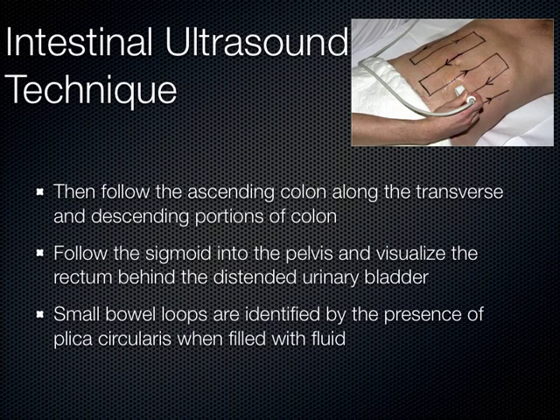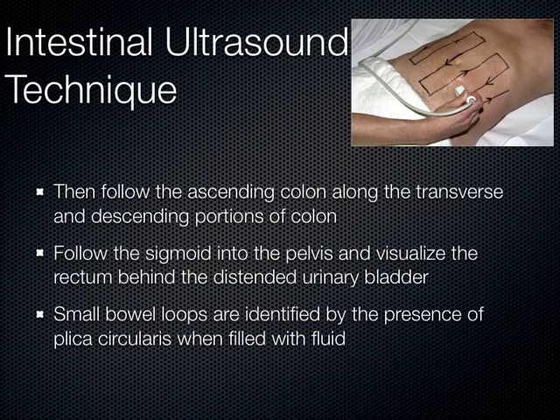When doing a focused appendicitis exam in the ER, I keep this mowing the lawn technique around the right lower quadrant where the appendix is — what we call McBurney's point. Sometimes I just hand the transducer to the patient and say 'put this where the pain is.' They push it on their abdominal wall, helping to localize where to start searching for the etiology of their pain.